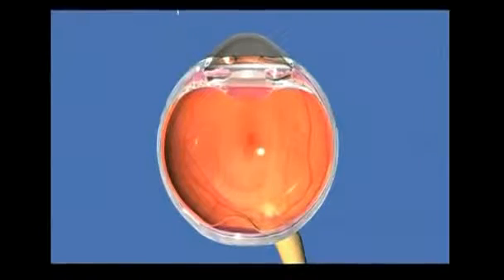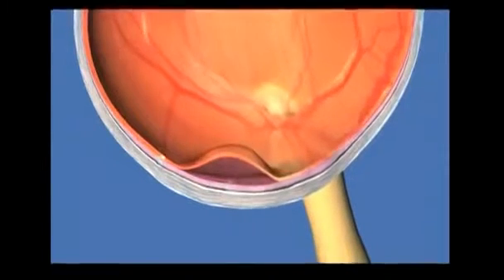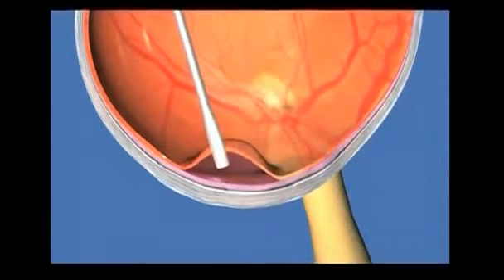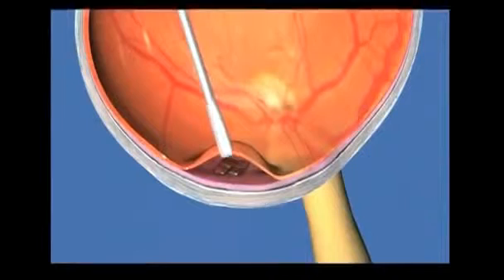Their goal is to prove that the system can restore vision to a level that would justify human clinical trials. Now, if we're able to prove a really high resolution, then suddenly the amount of patients that we can treat would go way up. So more than anything else, we have to prove that we're able to restore high resolution, which is something that we have been working on. Palanker says that if prosthetic limbs can allow people to move again, there's no reason why retinal prosthesis can't allow people to see again as well.